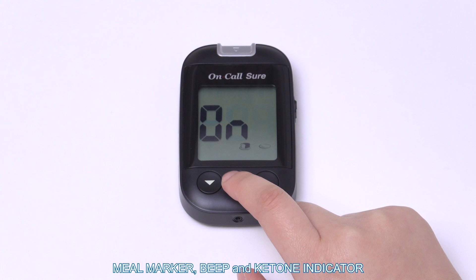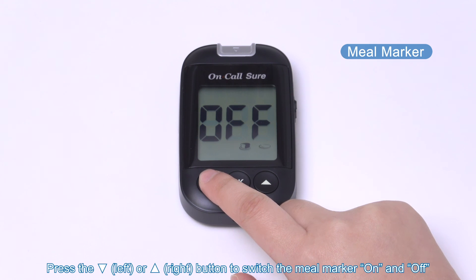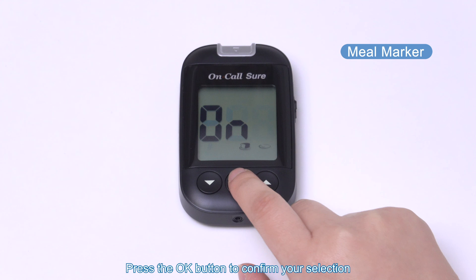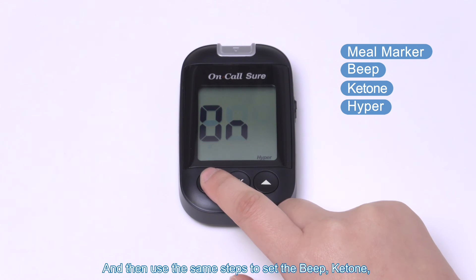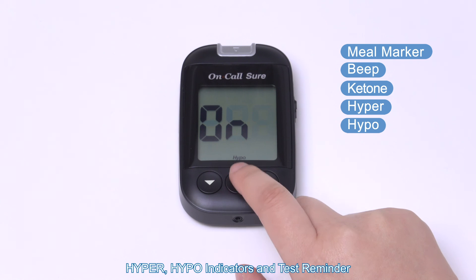Meal marker, beep, and ketone indicator. Press the left or right button to switch the meal marker on and off. Press the OK button to confirm your selection. Then use the same steps to set the beep, ketone, hyper, and hypo indicators, and test reminder.